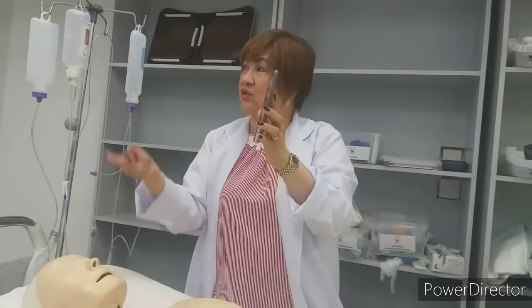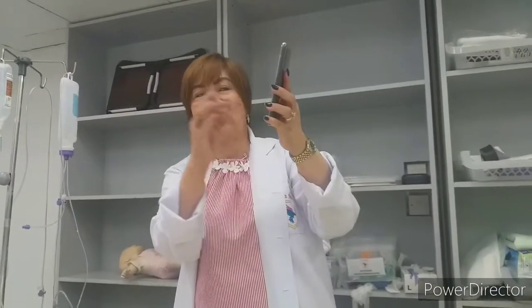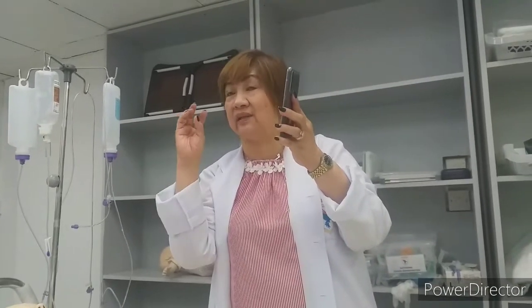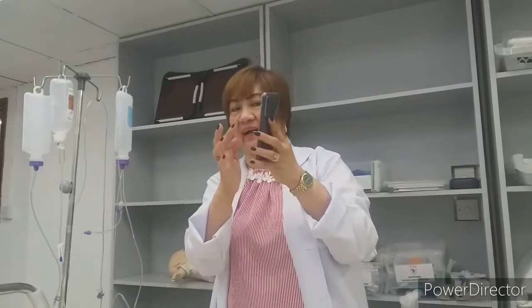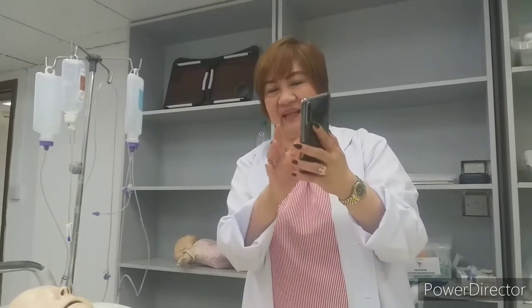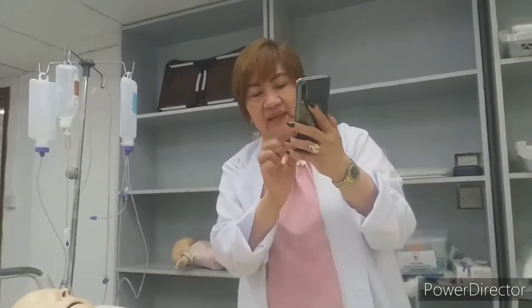They will teach you how to use it. You have to snap it, like the cup of coffee lid. If you did it wrongly, it will leak under, and the whole thing you will have to clean again and again.